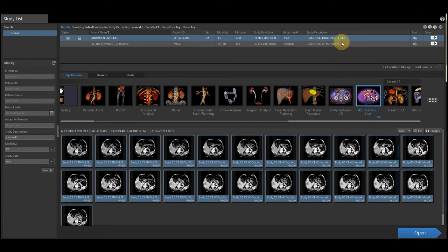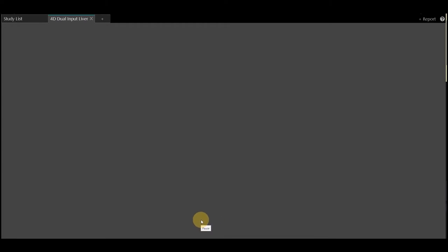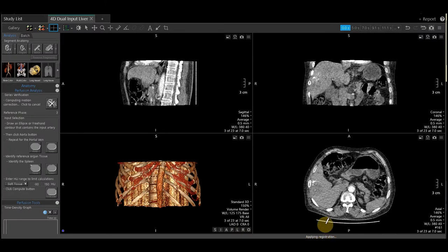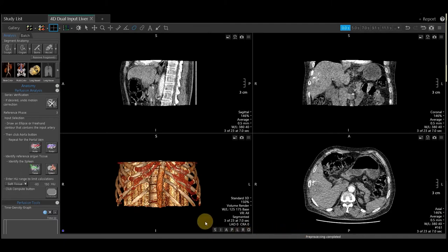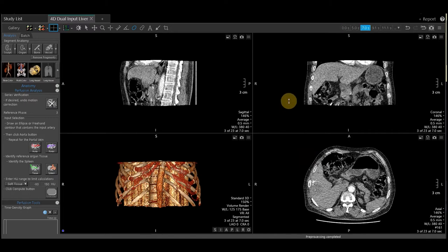Once you select your patient and this application along with all your perfusion data, select open to launch the application. As the application is launching, it does apply a motion correction and registration. Once the preprocessing is complete, to scroll through your images, hold your right mouse down.